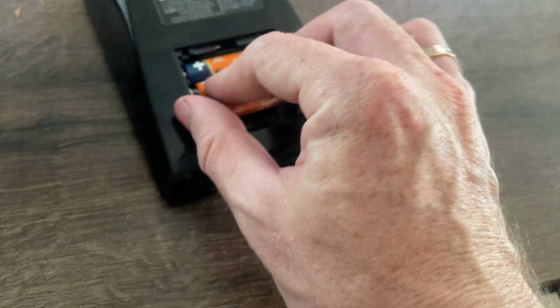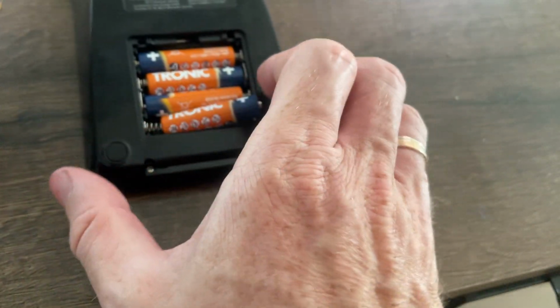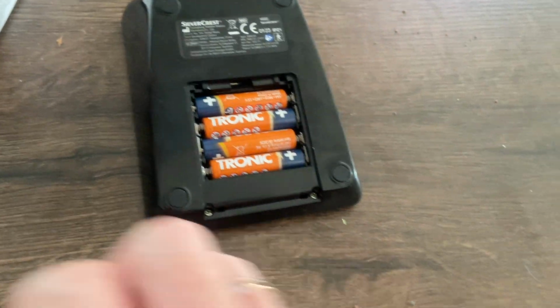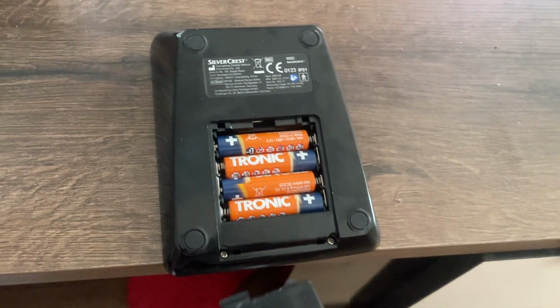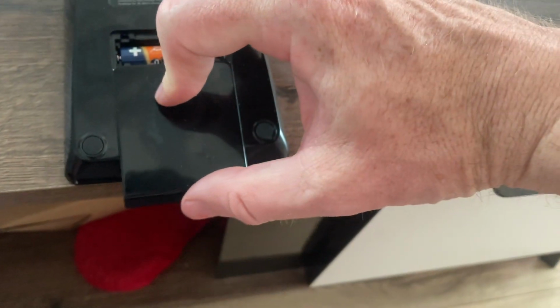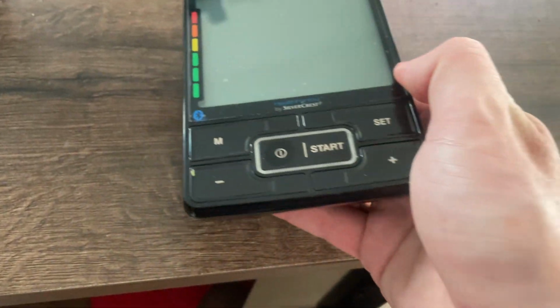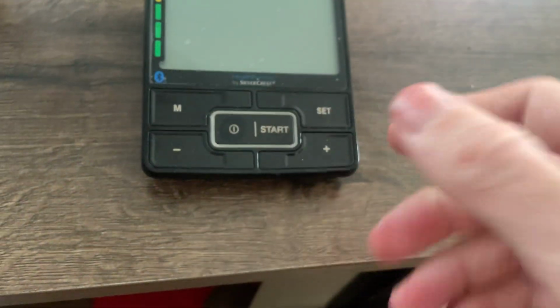So you need just four batteries. Okay, it's done. Now just take the cover and return this cover back very precisely. So right now it's ready for a test.